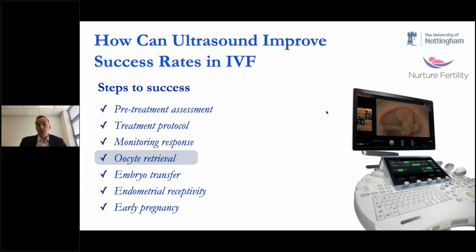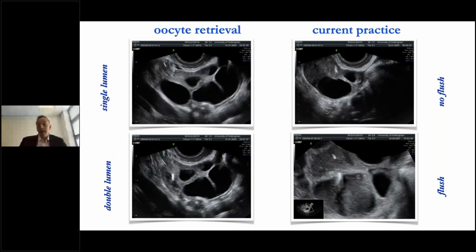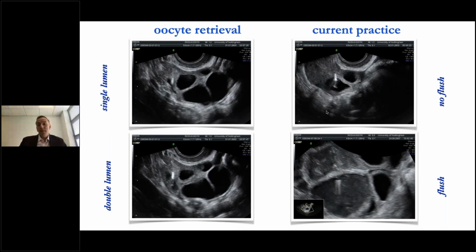I'll just get to embryo transfer and stop at that stage. So oocyte retrieval, for those of you who do IVF, again, a lot of should you aspirate or should you just drain? It's taken me many years. I grew up on flushing every follicle possible, and now I flush nothing. Potentially, maybe if we've got 1 or 2 follicles, but really we rarely flush.